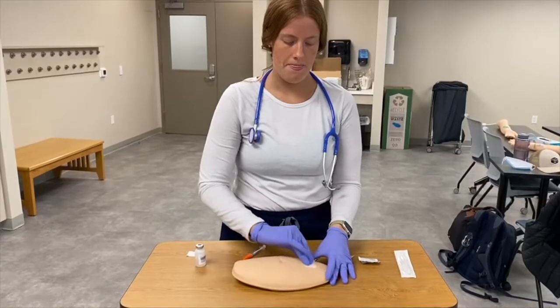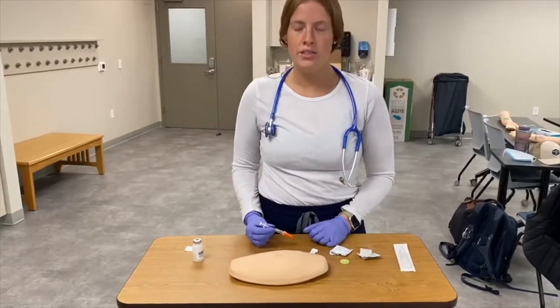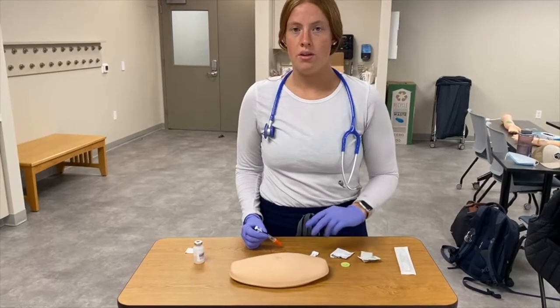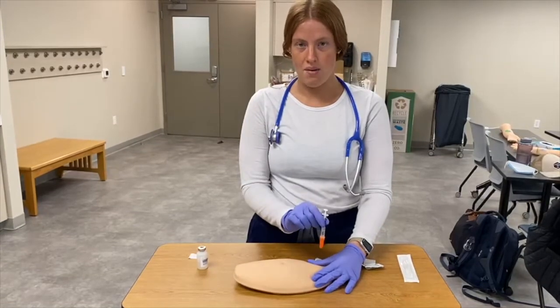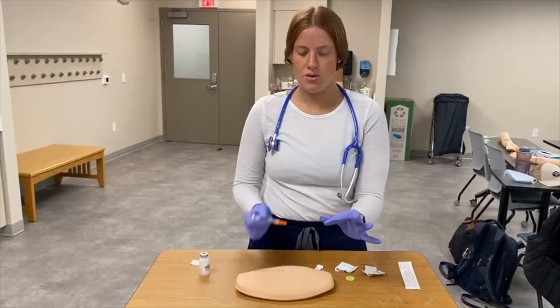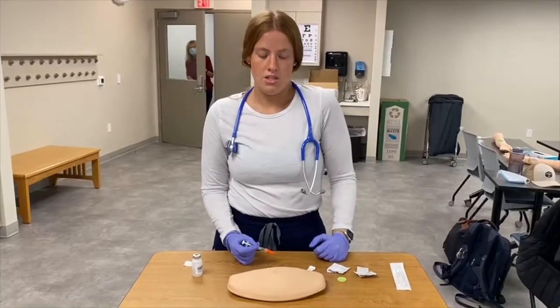Let that dry. When doing a subcutaneous injection, one technique is called 'pinch an inch' — you pinch a little bit to form the skin up and then jab it at a 90-degree angle. Make sure you're not pinching too close, because you don't want to accidentally stick your own finger.